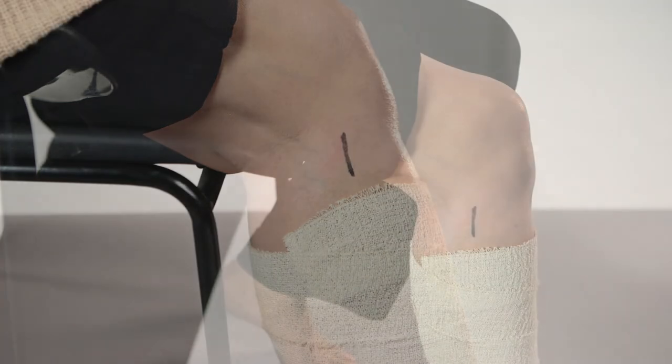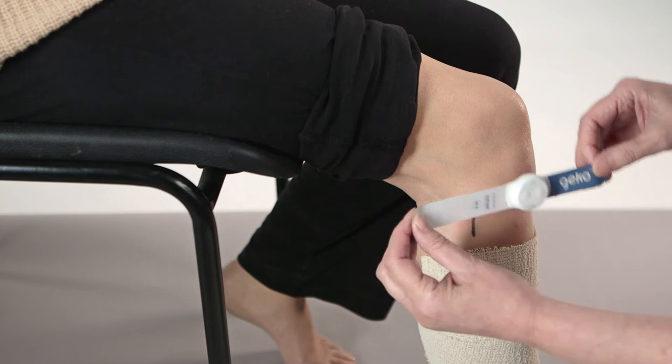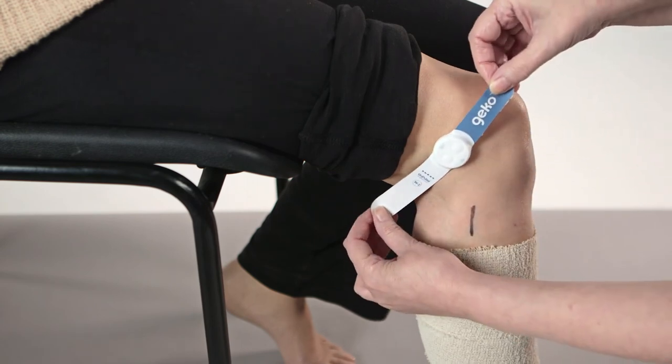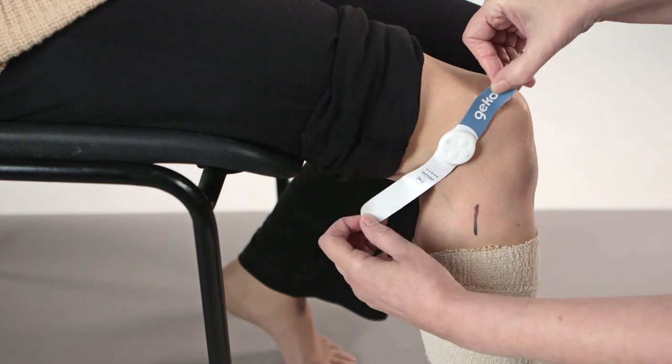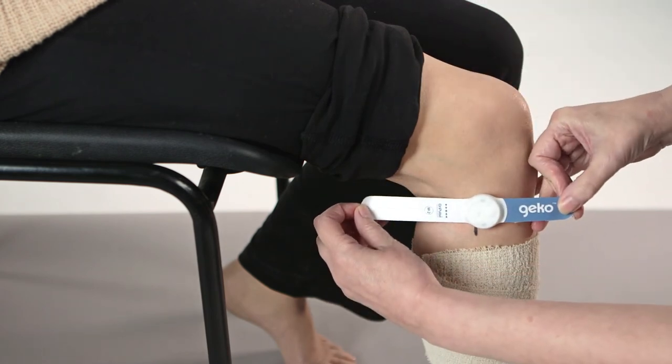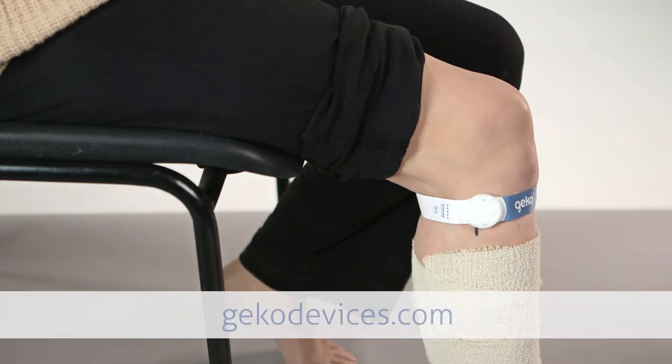If the primary fitting location does not produce movement of the muscles, stimulation may be achieved using alternative locations. After preparing the skin, apply the device either slightly above or below the crease at the back of the knee, with the location marker aligned with the outer lateral collateral tendon. See gekodevices.com for further details.